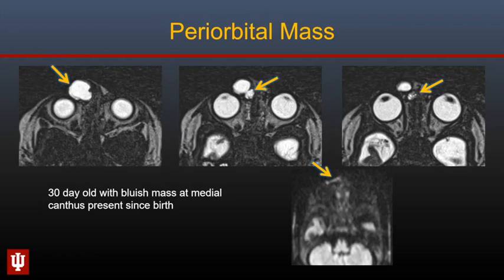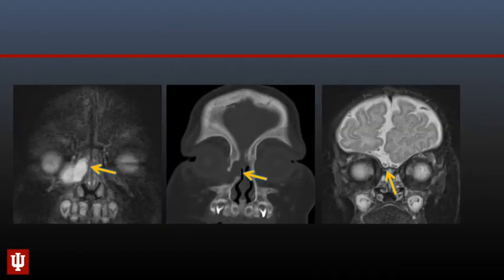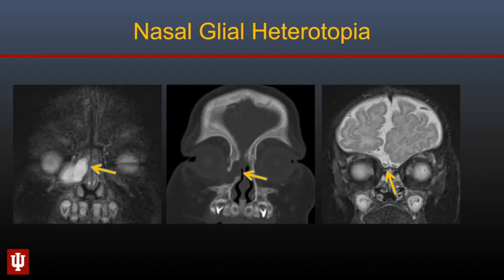Here is another infant who presented with a periorbital bluish mass along the medial aspect of the right orbit, present since birth. This mass is bilobed with an intranasal component and does not restrict diffusion. On coronal images, the intranasal component is tubular and extending cranially. On CT, it is impossible to distinguish true intracranial extension because the floor of the anterior cranial fossa is not yet ossified. However, on MRI there is no true intracranial extension, though there is a dysplastic appearance of the inferior right frontal lobe. This lesion is a nasal glial heterotopia.